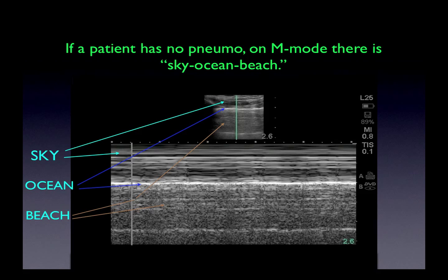If we change from B-mode, or brightness mode, to M-mode, or motion mode, there's what's been nicknamed sky-ocean-beach. The light blue line reveals what is called sky, which is the subcutaneous tissue above the parietal and visceral pleural interface. The ocean, shown with the darker blue line, is the interface itself. And the brown arrow indicates what has been called beach — the sandy appearance. This is what's seen if a patient has no pneumothorax.